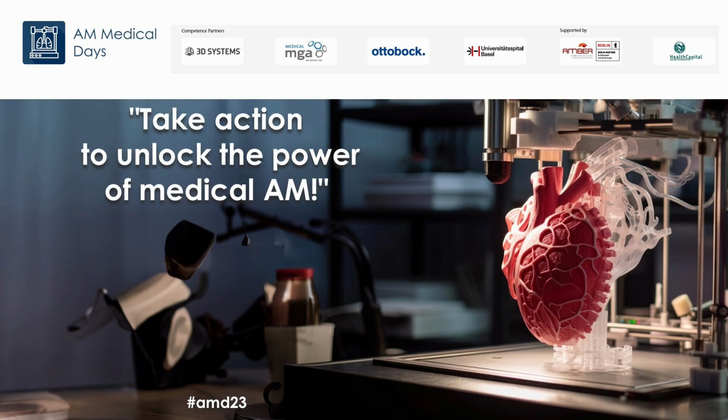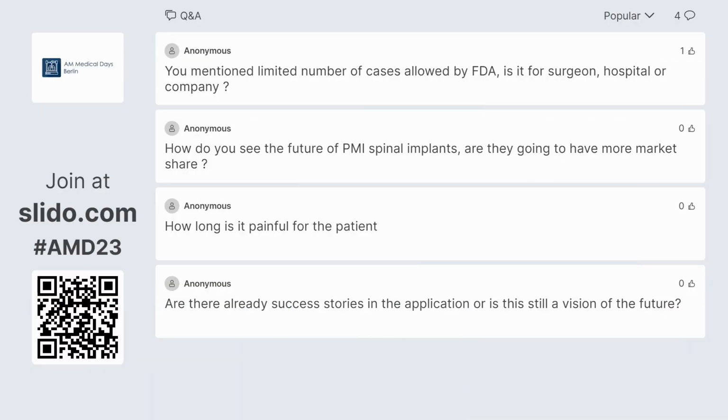How long is it painful for the patient? Well, that's a very good question, but it heavily depends on the surgical procedure. For the spine cases, I know that the surgeons in private practice do surgery in 45 minutes. It's faster than filling a tooth. But when it comes to cases like a hemi-pelvectomy implant, that took about a day. And the longer the operation, the more the complications. A lot of times patients with those have to come back several times, have infection, it's a big problem, and many other things.